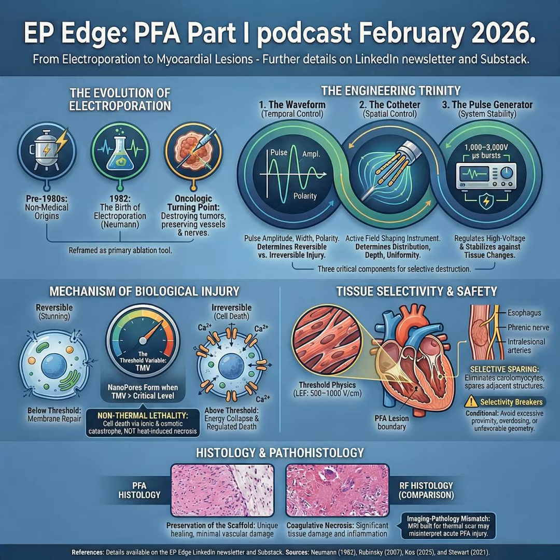So RF took over. With RF, we gained controllability, thermal lesion creation with a more predictable workflow. Then cryo developed into its own niche, including balloon-based strategies for pulmonary veins. And now PFA arrives not as an entirely new idea, but as a controlled re-engineering of the electrical injury concept that DC ablation introduced, minus the chaos. That phrase, controlled re-engineering, is the right mental model, because modern PFA is not a shock. It's a finely engineered system.